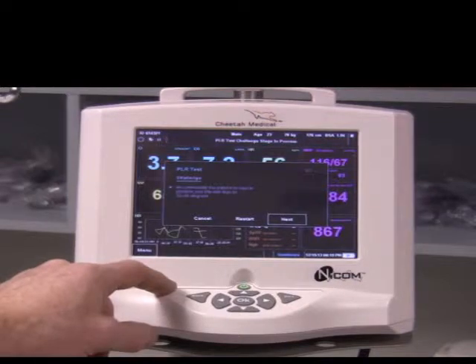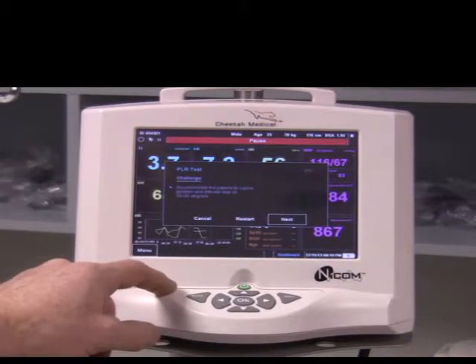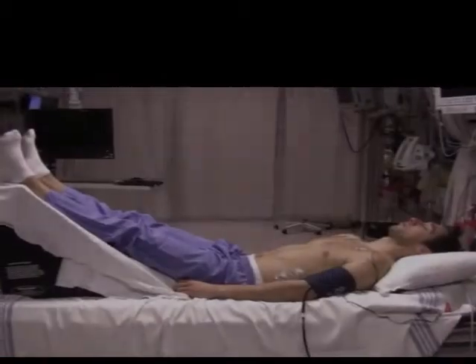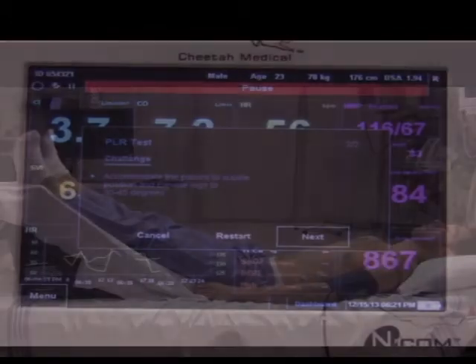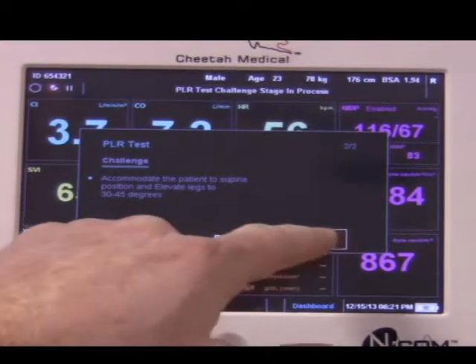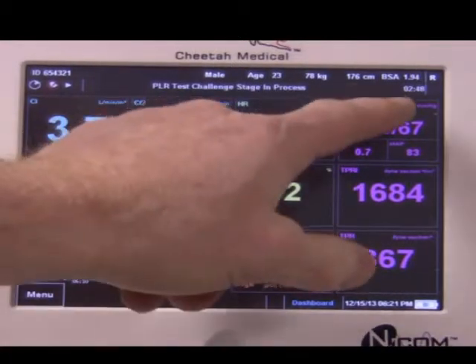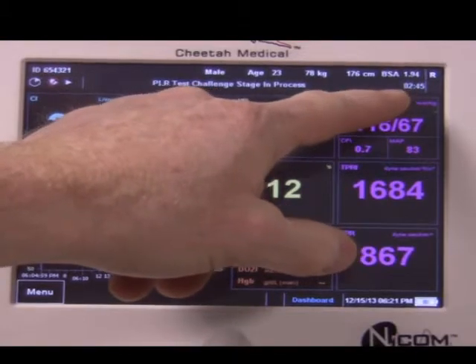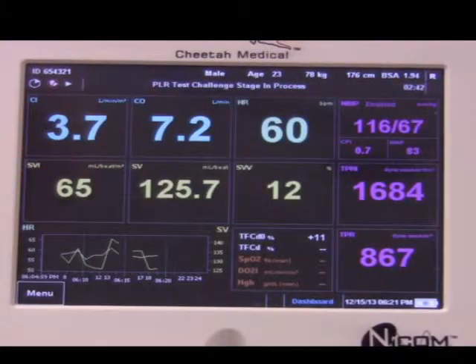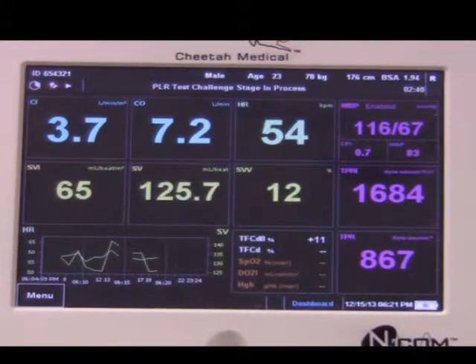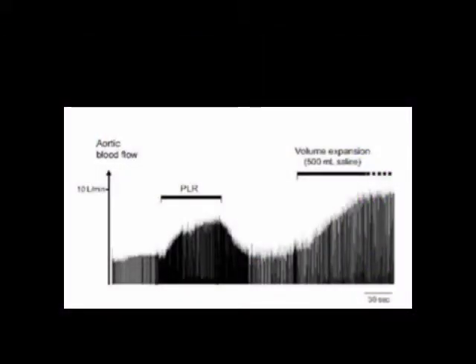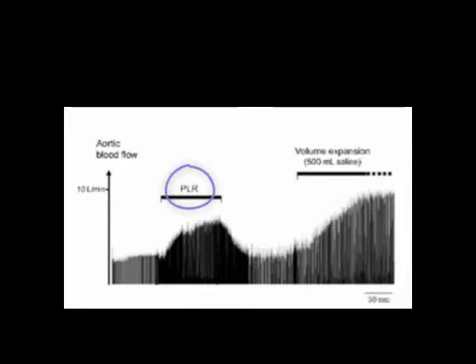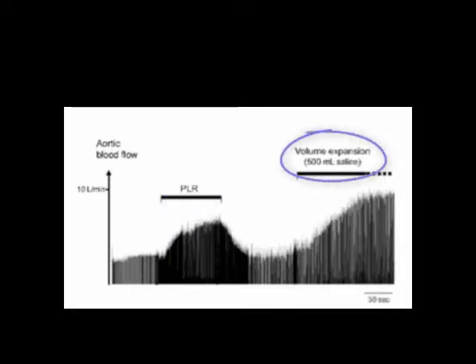It now says: accommodate the patient to supine position and elevate the legs to 30 to 45 degrees. Once the patient is positioned with the head down and the legs up, we press Next. In the top right corner, a countdown for the test commences, indicating that we have about 2 minutes and 45 seconds remaining. The passive leg raise maneuver is equivalent to the reversible administration of about 1 unit of blood. This diagram illustrates the change in aortic blood flow over time with the passive leg raise maneuver and the administration of 500 mL of saline.